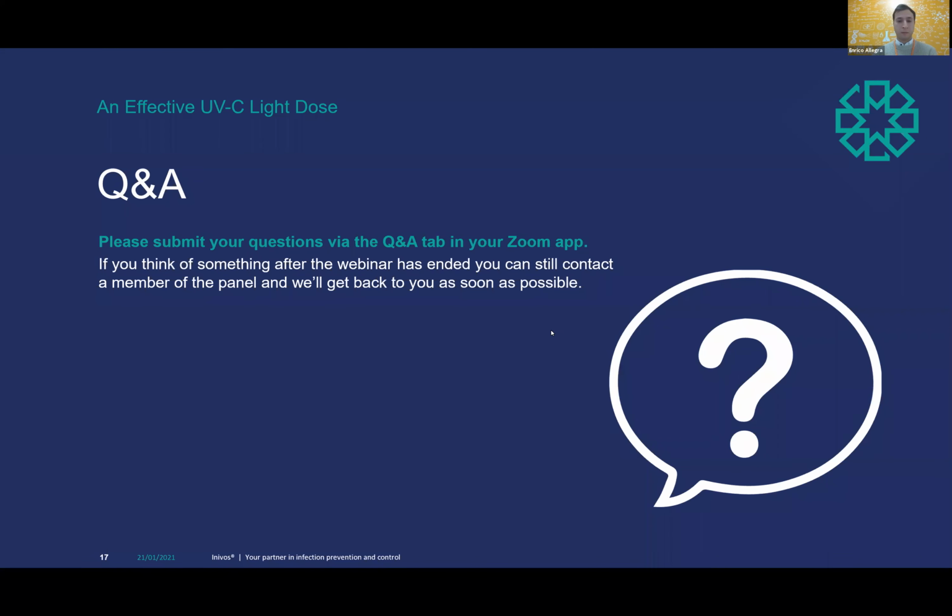One of the questions is: is it possible to measure the dose of UV at a specific point? The answer is yes, and that's how the trials are being done. If you look at the tests, reports or studies, they do measure the dose. That's how they arrive at whatever the Z value is. What's sometimes missing is how long it took to get that specific Z value, and what the circumstances were, like temperature and humidity, to give a fuller picture. Because the risk is that if you use that Z value and achieve the same value over twice as long a time, is it still effective?